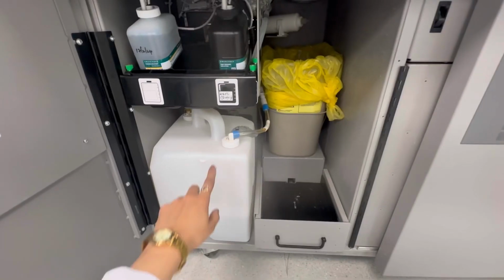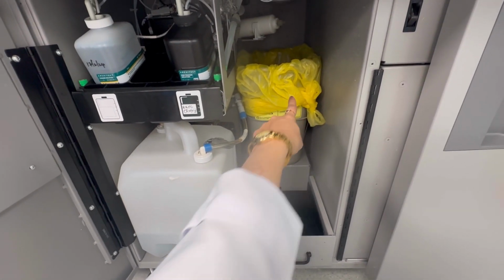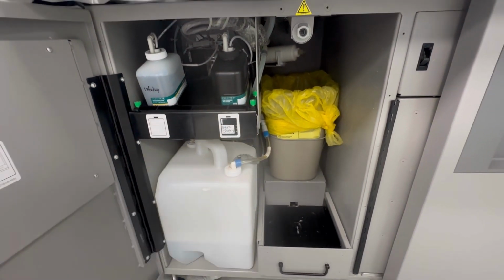What are the supplies? This is the buffer. Okay, we are using, that is a solid waste. Here we have pre-trigger and trigger. These are all we will be using in the machine. And here also we have some solution.